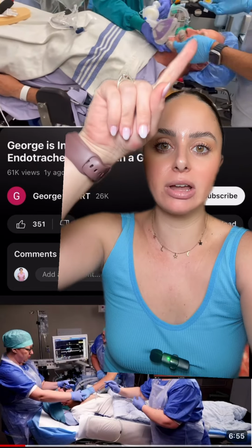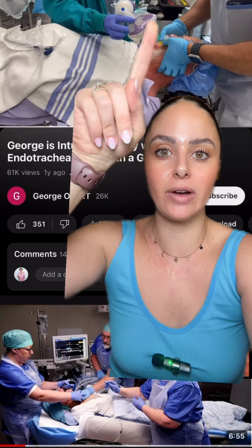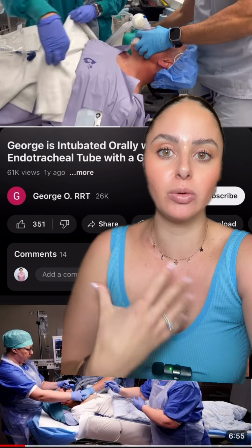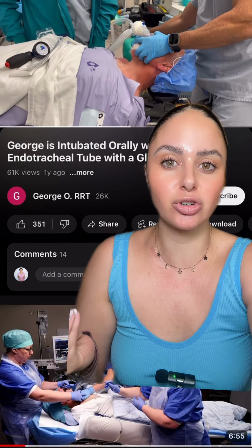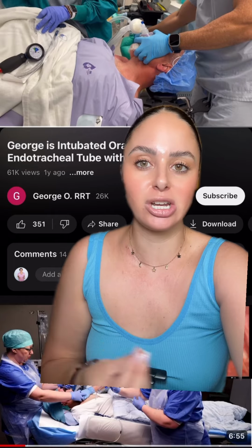The provider here is now going to insert an OPA in order to keep that patient's airway open and is going to provide them with some oxygen. You'll see here in a second that he's going to squeeze his little bag in order to ventilate the patient, and you'll be able to see the patient's chest rise and fall. We don't always do this step in the ICU. Usually we go straight from giving the medications to intubating, but here he is allowing the patient to fall a little bit more asleep.